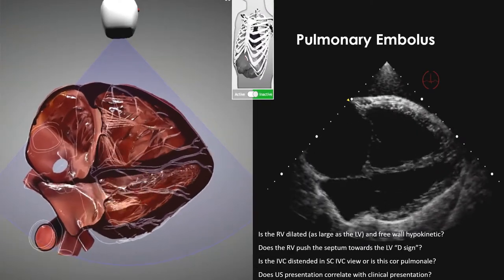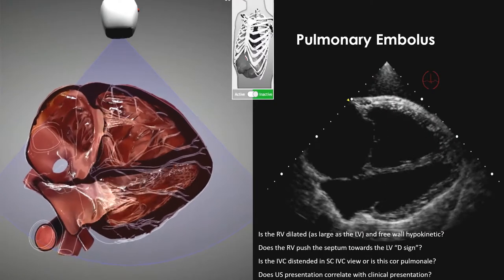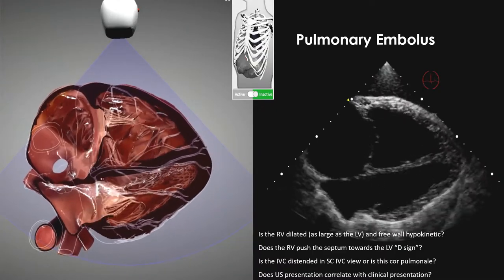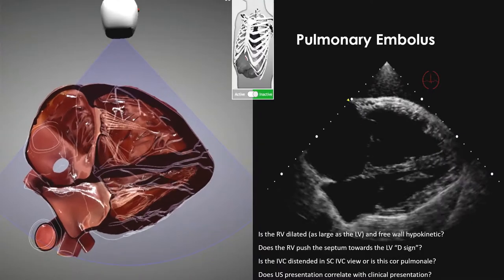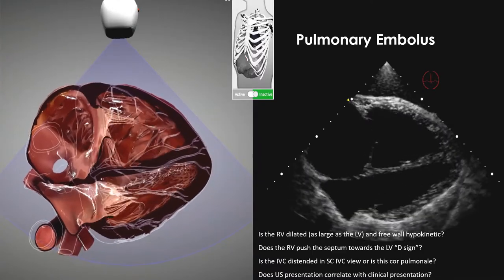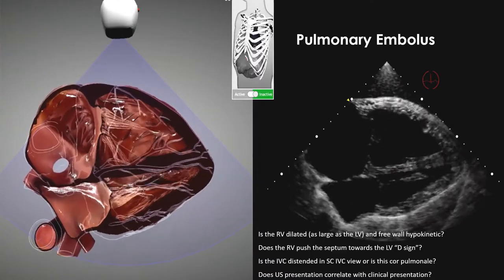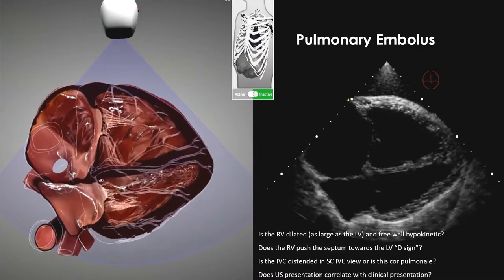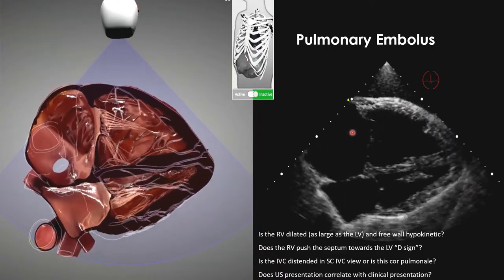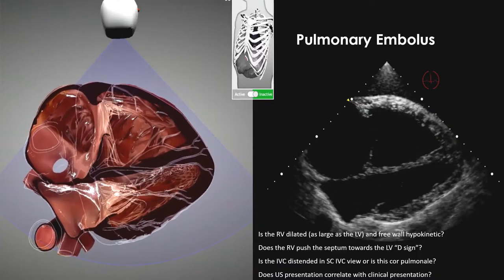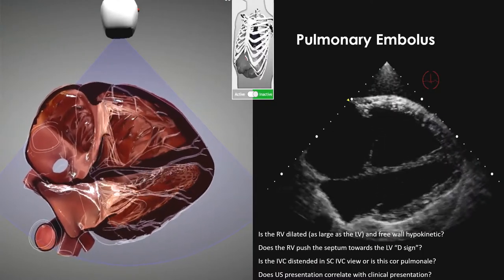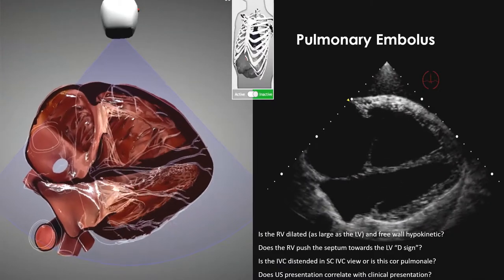PE is seen in the cardiac OR not infrequently — usually chronic or CTEPH. In the subcostal four-chamber view, it's pretty obvious: the RV is huge, the RA is massive, and with color Doppler you'd see significant TR. The free wall is not moving but the apex is preserved — that's McConnell's sign. The IVC view shows a huge dilated IVC.